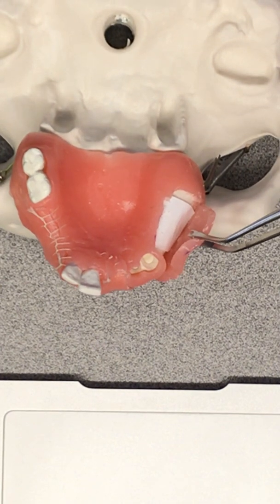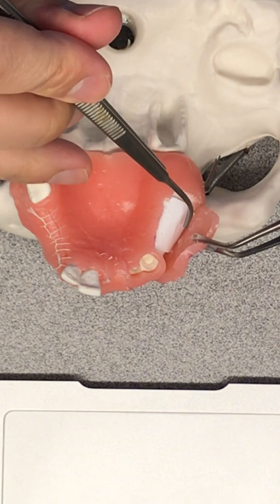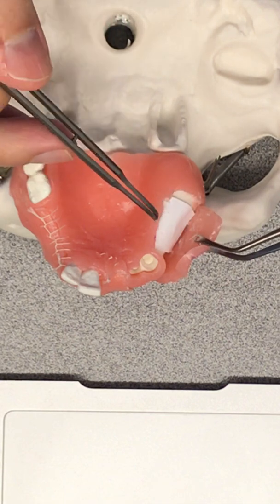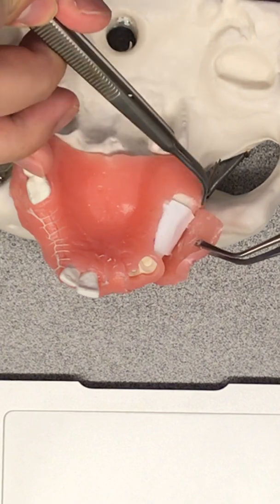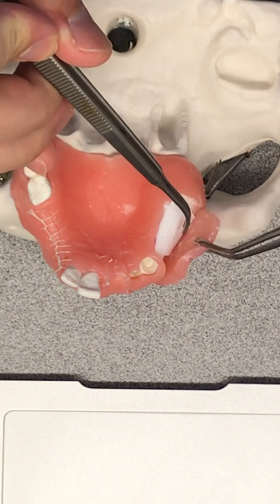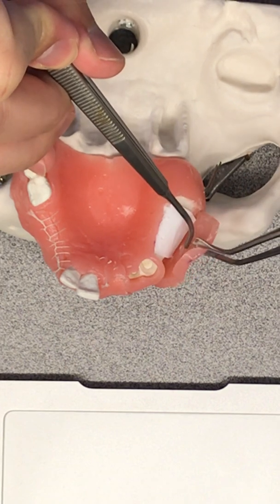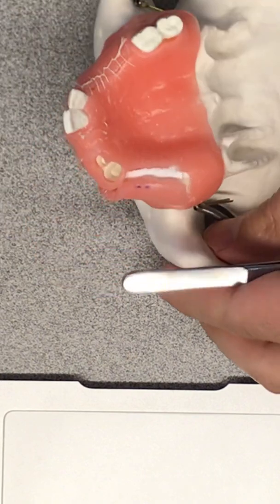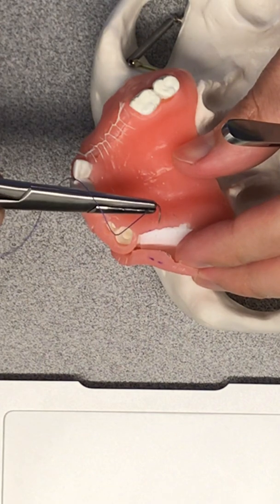After placing a bone graft and covering it with the membrane, sometimes we like to strap in this membrane using the palatal flap and the remaining periosteum. After we create a periosteal fenestration to have more flexibility in the buccal flap, we have some periosteum left on the apical portion of the flap to perform the strapping sutures. We would like first to enter the palatal flap.